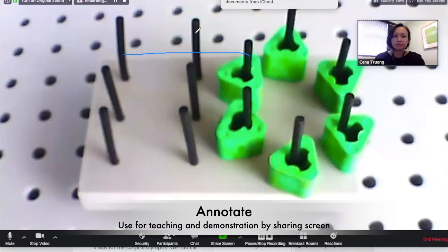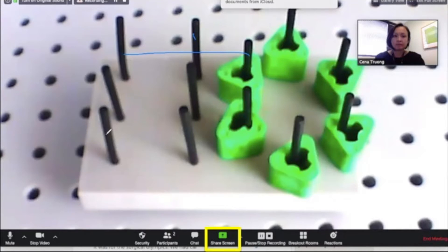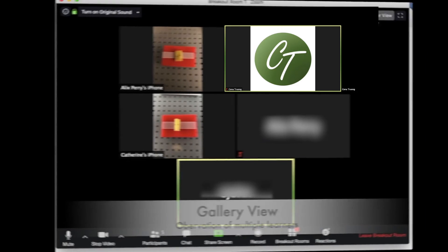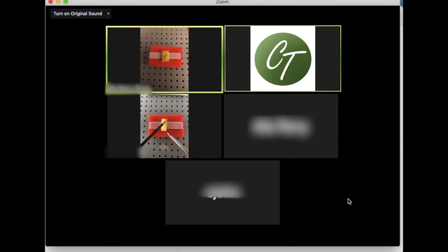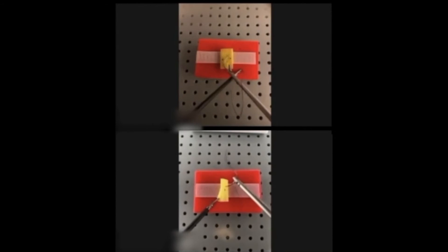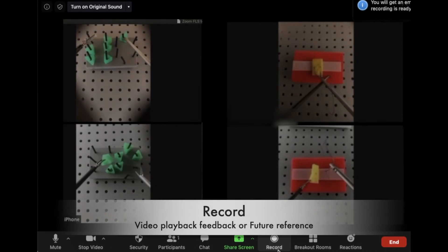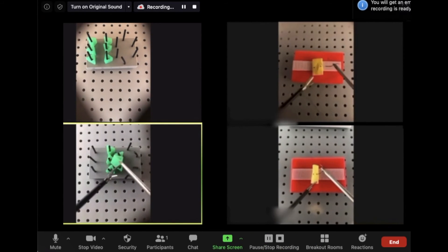The annotate function can be used to help with teaching and demonstration by sharing the screen with learners. The gallery view allows for observation of multiple learners at one time. To hide the laptop feed without video, select Hide Non-Video Participants. Lastly, the record function can facilitate playback for feedback or for future educational reference.